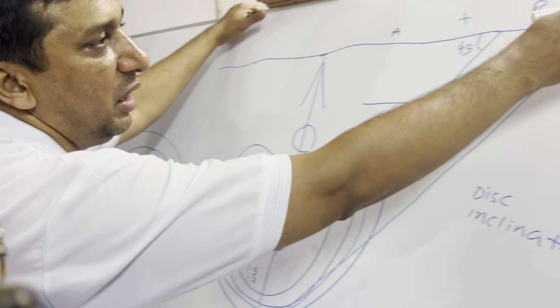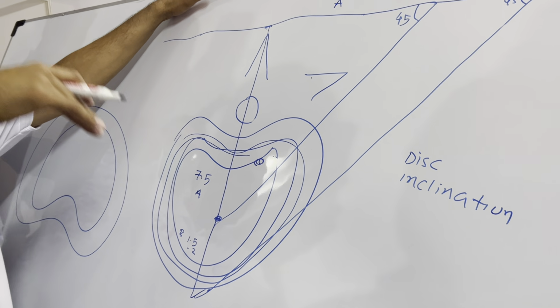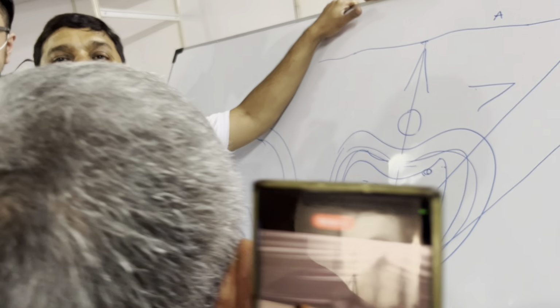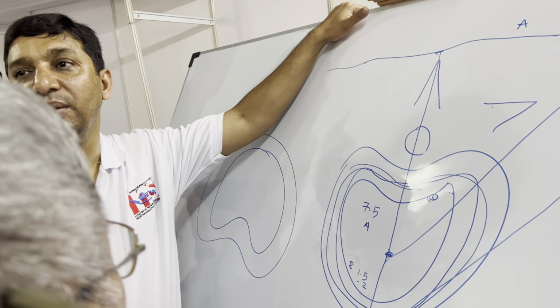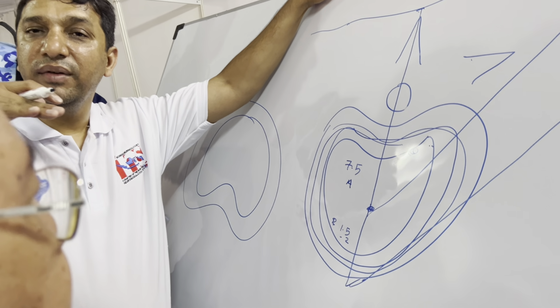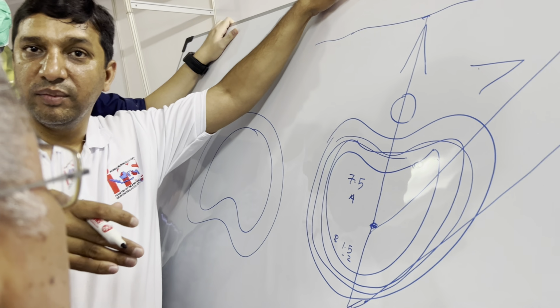Then what we do is start from here, try to hit the facet, and then try to go below the facet. You try to be very close to the facet so you will not injure any nerve, because that area is very fixed. And since the dilator has a conical, bullet shape, even if the nerve is in between, it is going to retract the nerve. This way, you can go to the disc.